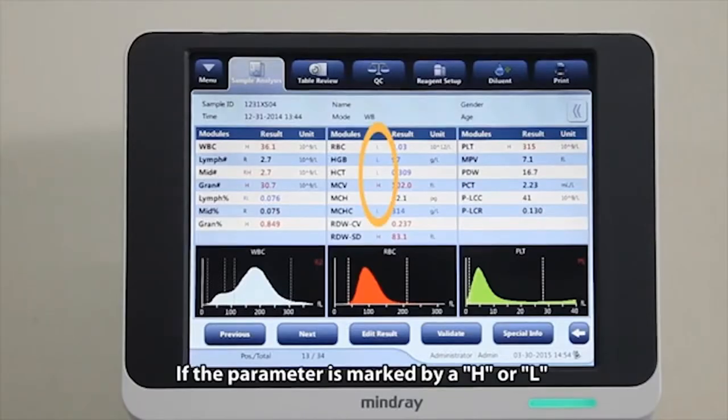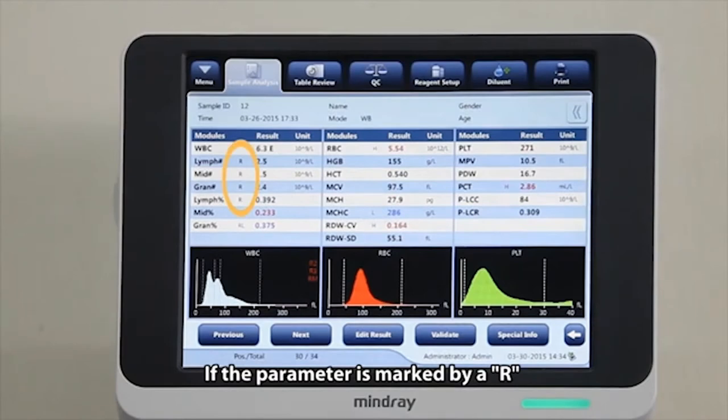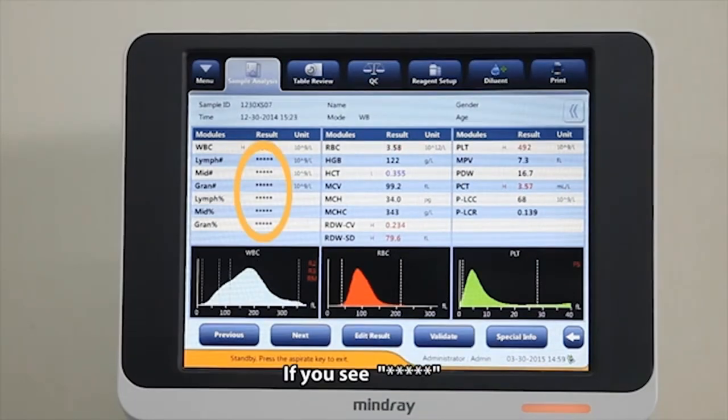If the parameter is marked by an H or L, it means the analysis result exceeds either the upper or lower limit of the reference range. If the parameter is marked by an R, it means the analysis result is questionable. If you see 5 asterisks, as opposed to the result, it means the result is invalid.